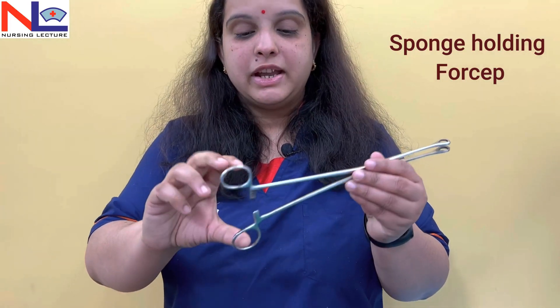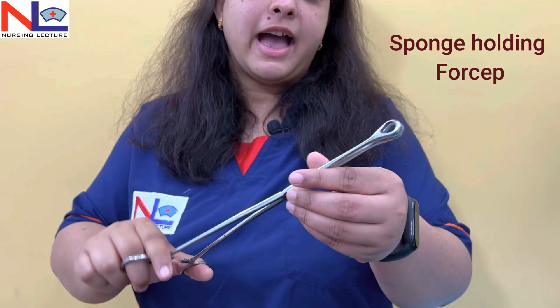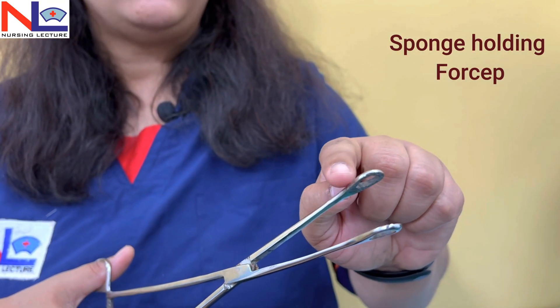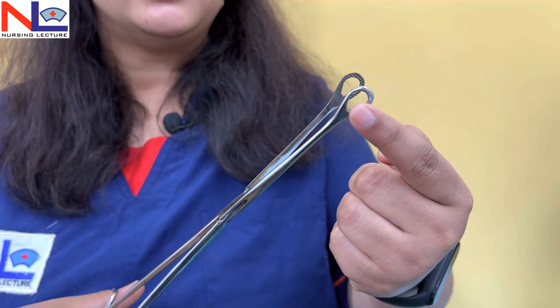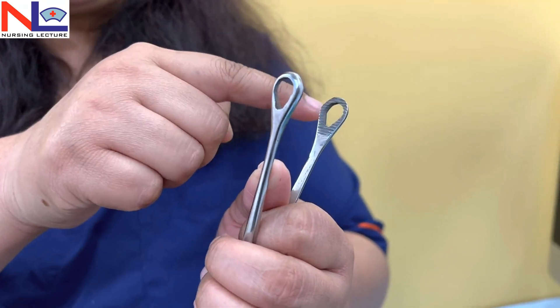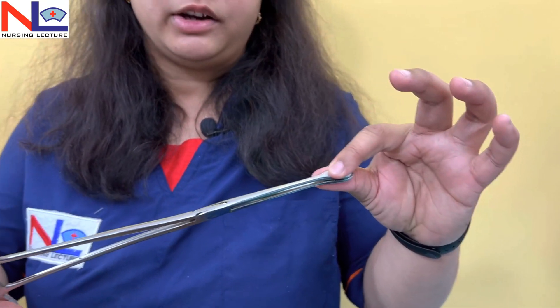By this instrument we take out the products of conception and retained bits of tissues. The next instrument is the sponge holding forcep. Here you can see there is a ratchet lock, and on the tip you can see there are two round fenestrations and some transversely arranged serrations as well.